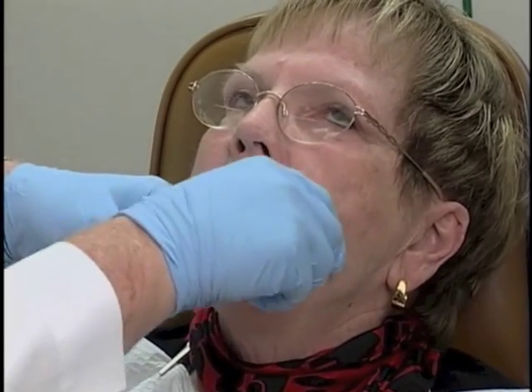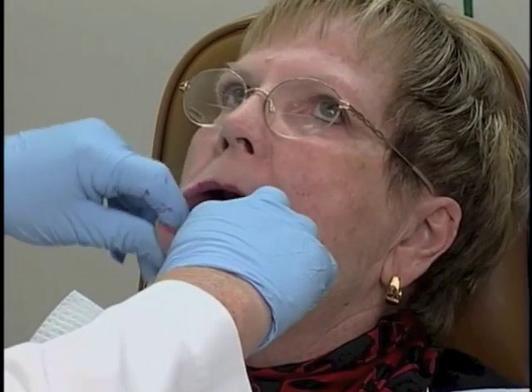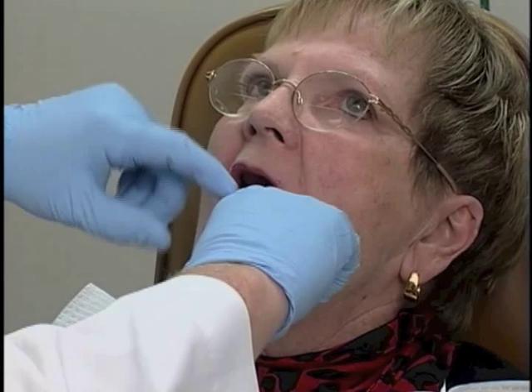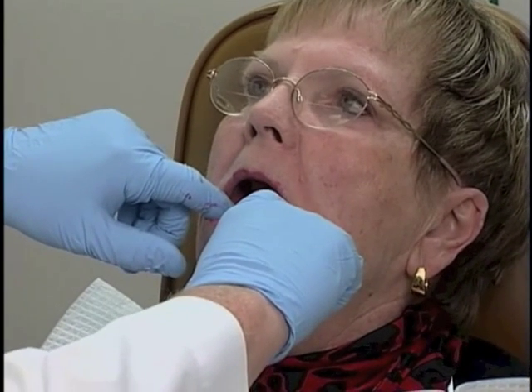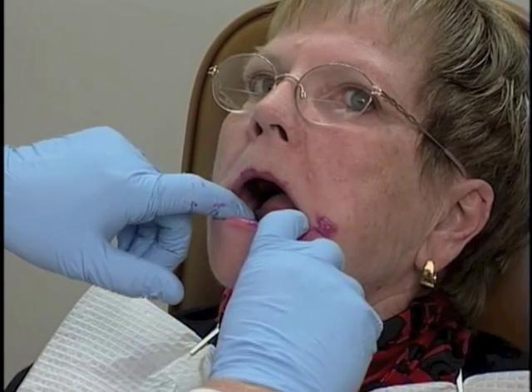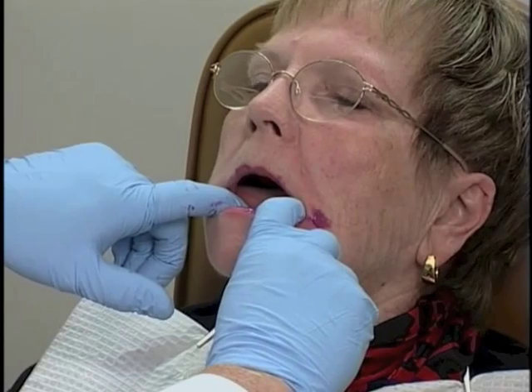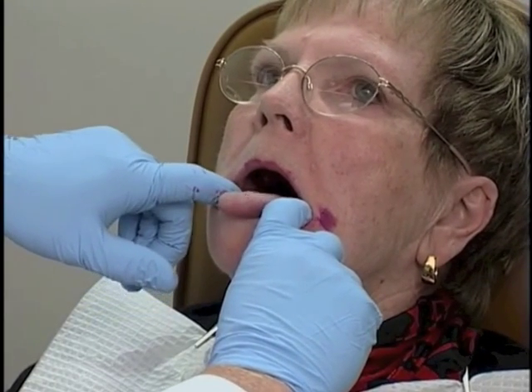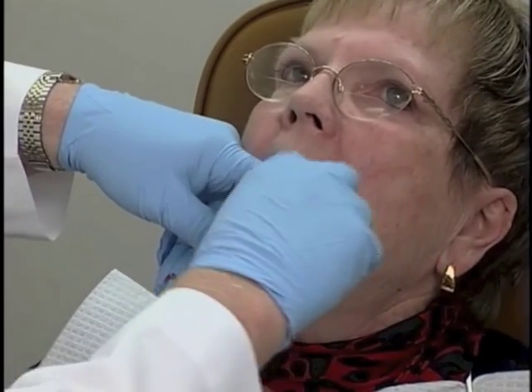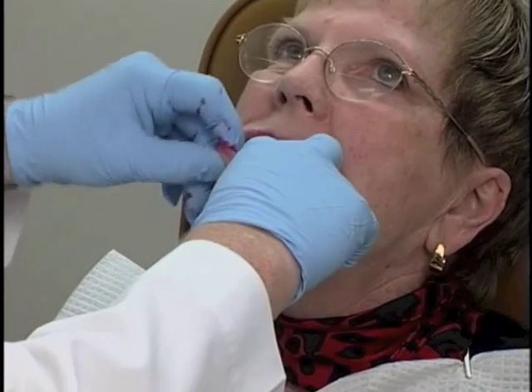And now I'm going to border mold continuously each buccal, the labial, and the lingual. Now put the tip of your tongue straight out at me. Put it into your left cheek, into the right cheek, straight out again. Now just let it relax on top of it. And I usually do this continuously until I feel that the material is no longer going to run.